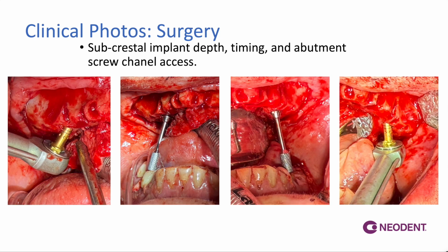Here we are verifying the proper timing of our middle implant, the posterior tilted, anterior to the sinus. On the left side of the screen, you can see that we are vying for a 1 millimeter subcrestal position of that implant. And then I have now placed a 1.5 30-degree multi-unit abutment. And I close the patient down.